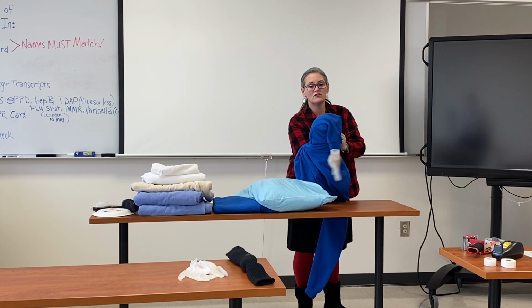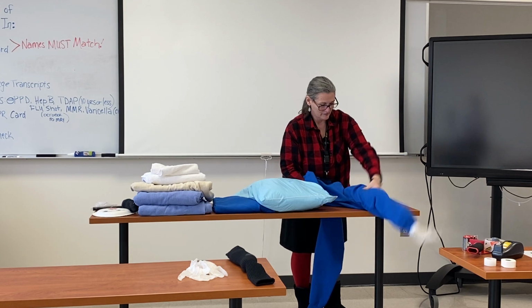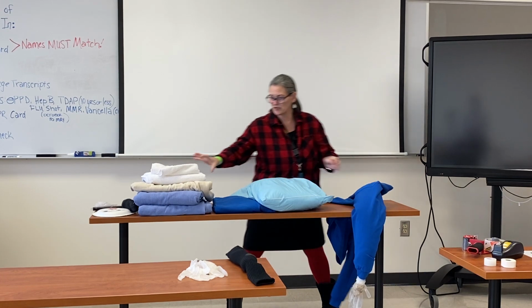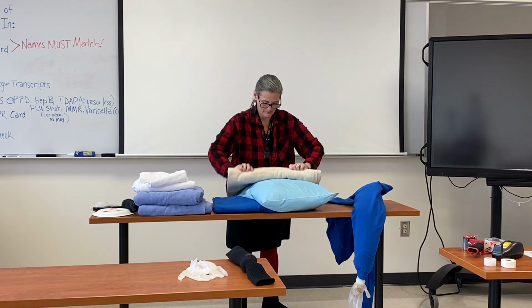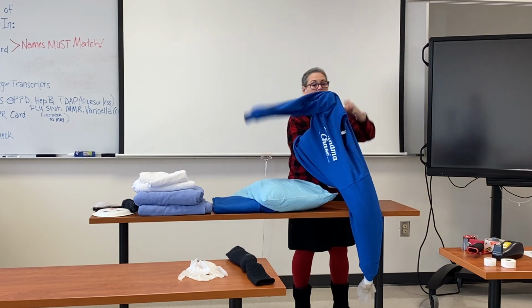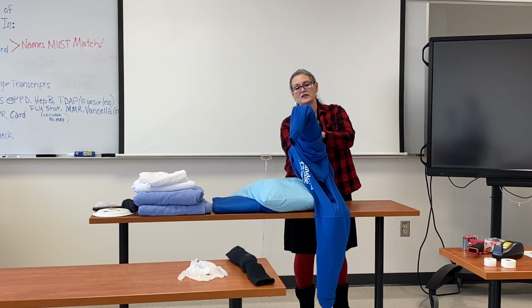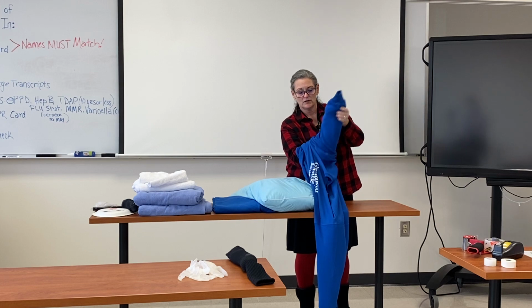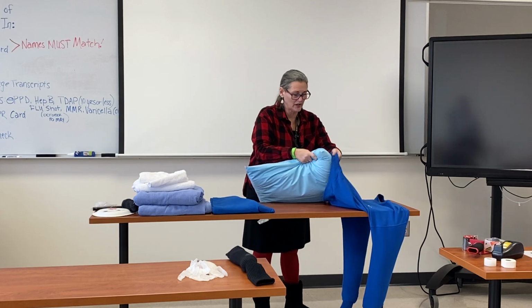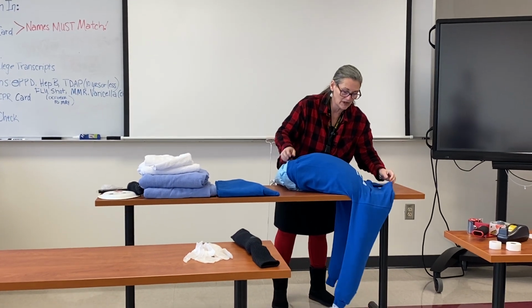Take your arm with the towel, your sleeve with the towel, and your arm in the sleeve. Ta-da! Granny's got an arm. So obviously you would do this on the other side. Granny's sprouting arms like some kind of demonic monster. How about that? So now Granny has two arms. She's a little limp, but that's okay. We're just going to use her to be able to practice to do your clinical skills at home.